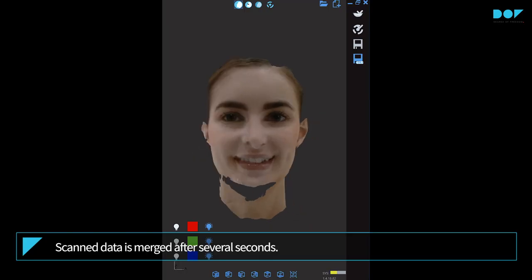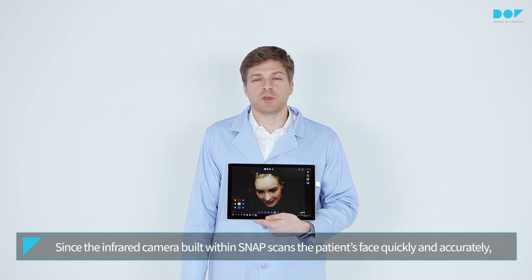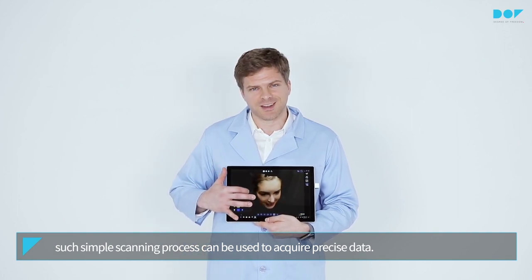Scan data is merged after several seconds. Since the infrared camera built within Snap scans the patient's face quickly and accurately, such a simple scan can be used to acquire precise data.